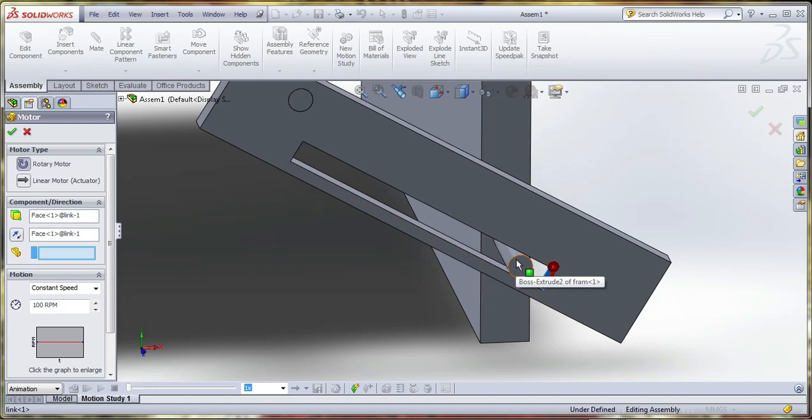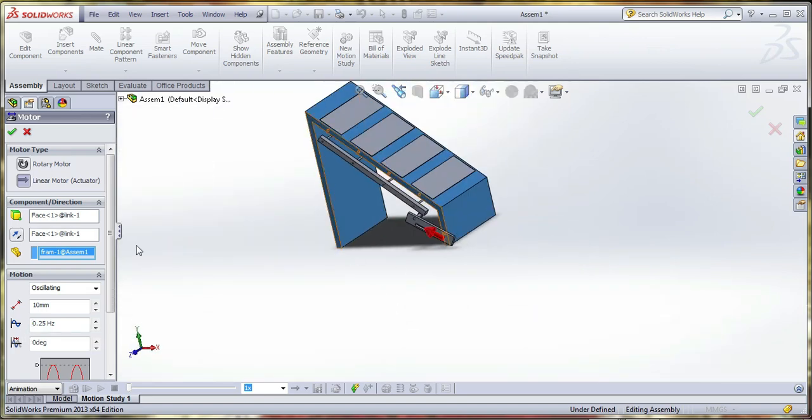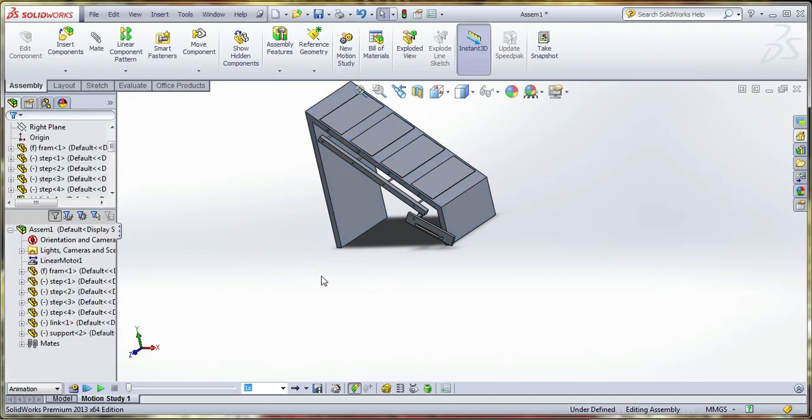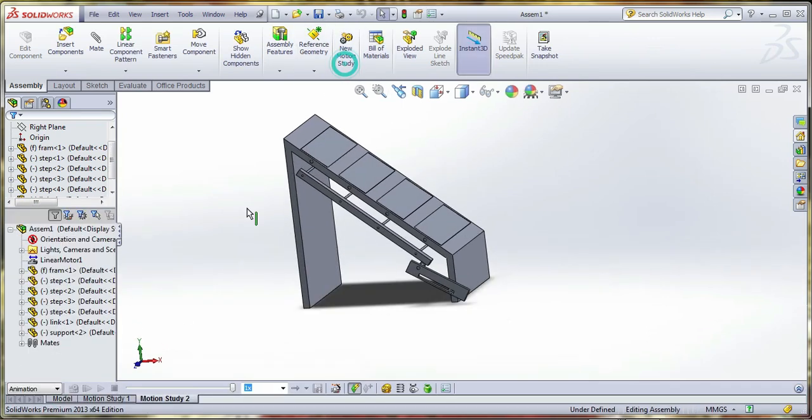We're going to go to mechanism motion study and select the motor. Okay, the linear motion and oscillating one. The distance is 10. The hertz is 0.25. Now it is okay. You can animate. Okay, excellent, but it is animating in the opposite direction, so you can change the direction now.